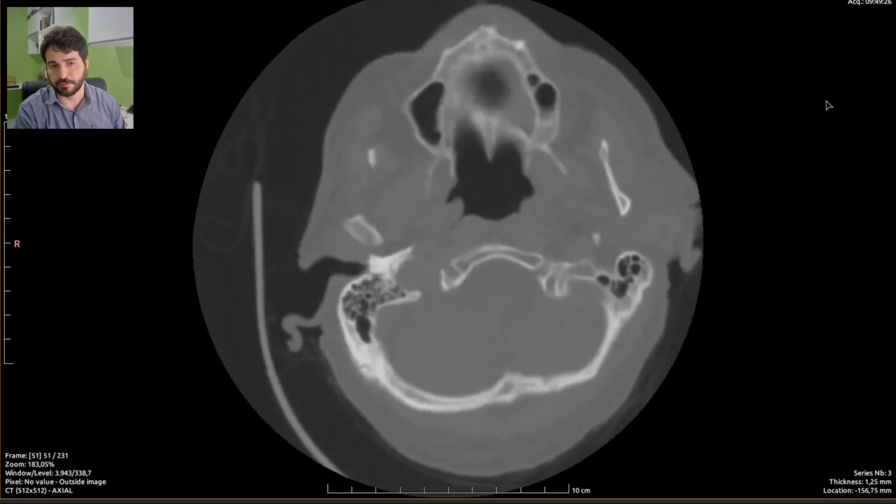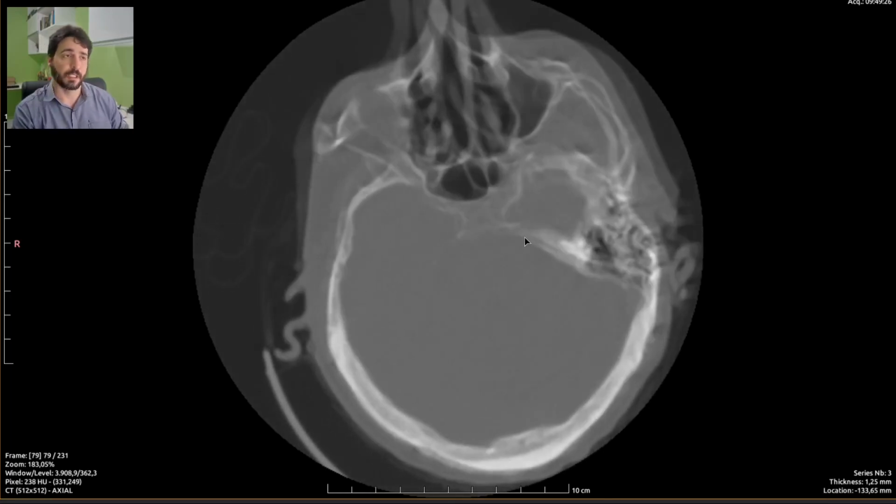To avoid this kind of behavior, you should properly position the patient on the table and attach a strap, a cloth or fabric strap, to the head of the patient. So the head of the patient is held secure in position and you can actually scan the patient. In some hospitals and clinics, there is no such strap. It's usually a very old scanner, or it has been lost or broken and never replaced.